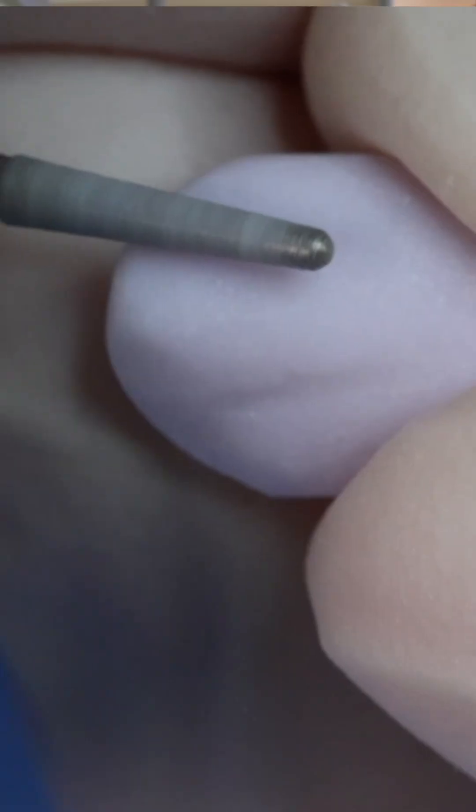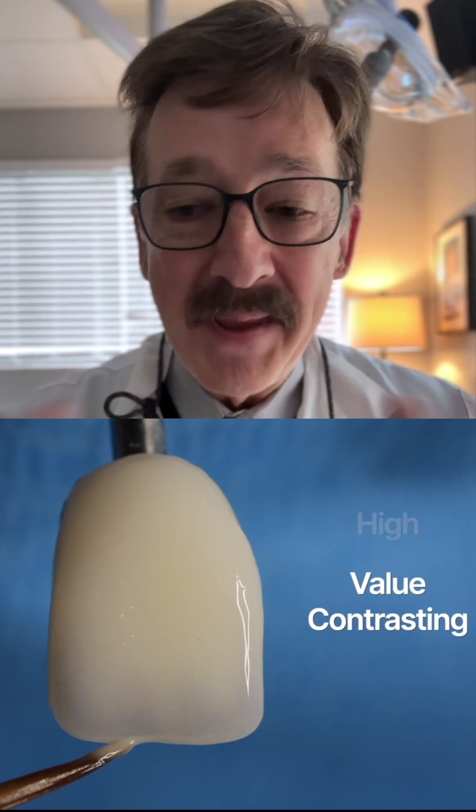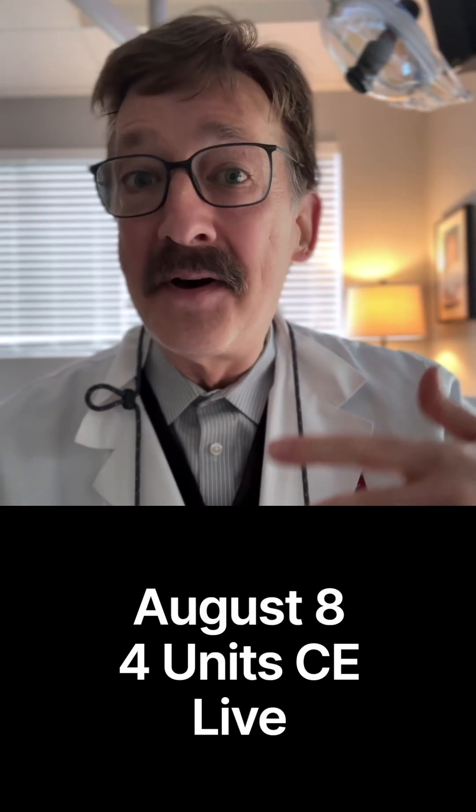Also the finishing, the texturing, and what I put on the surfaces to make those veneers look magic. I love conservative veneers and I do a lot of them. Hope to see you there — the next class is August 8th. It is a live class, so you'll get online credit for that in the comfort of your home.